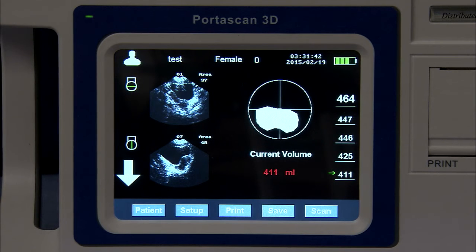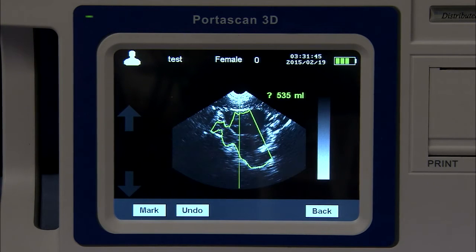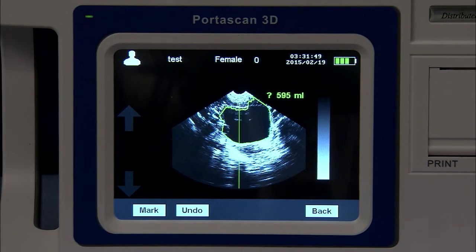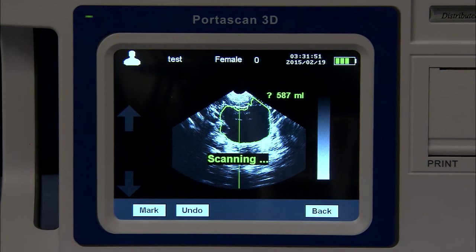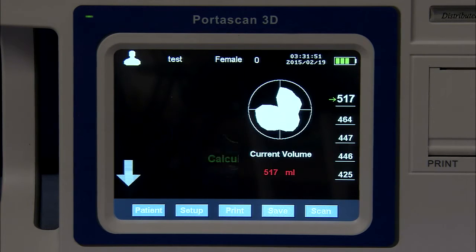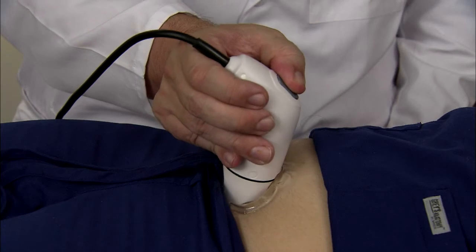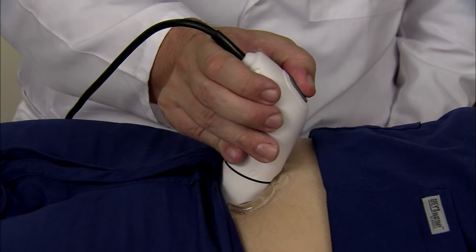Once you have obtained the first scan, it is always suggested you perform a second scan. This enables you to validate that the accuracy of the first scan is within 10%. While the scan is occurring, you will hear a beeping sound. It is always important never to move the probe during this sound, as it is taking 12 separate images of the bladder. If you move the probe, you will get an inaccurate reading.